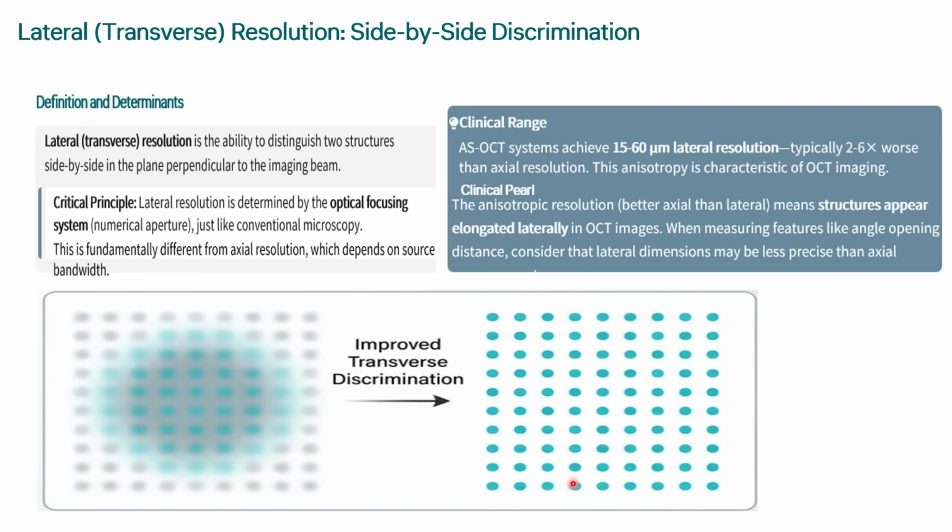We'll explain later on about the disengagement between the axial resolution and lateral resolution, but just keep in mind that the axial resolution represents the anterior-posterior ability to discriminate between points that lie coaxial with the examining beam. However, the lateral resolution is the ability to discriminate between two points that lie perpendicular to the examining beam. Now these points lie perpendicular to the examining beam. However, for the axial resolution, there is one here and one behind it, so they are coaxial with the examining beam.